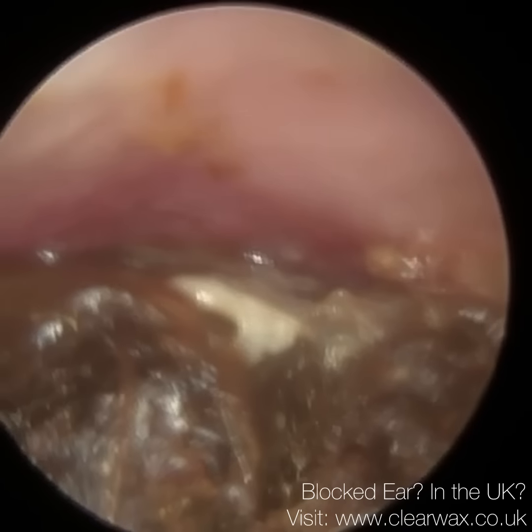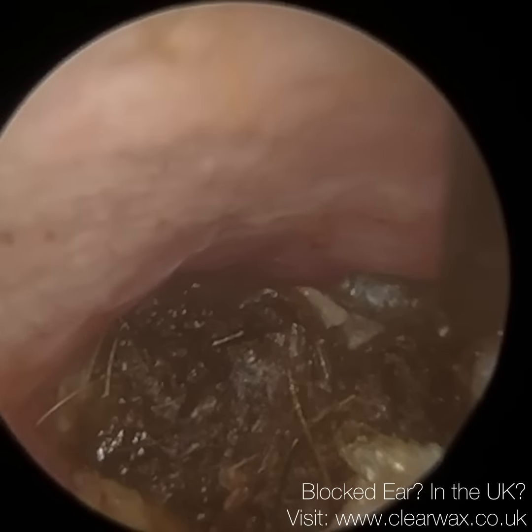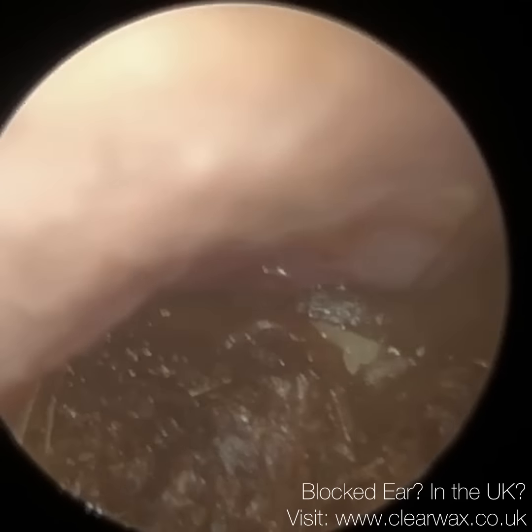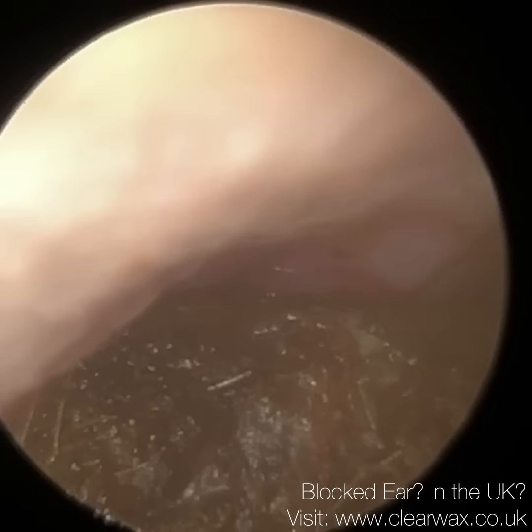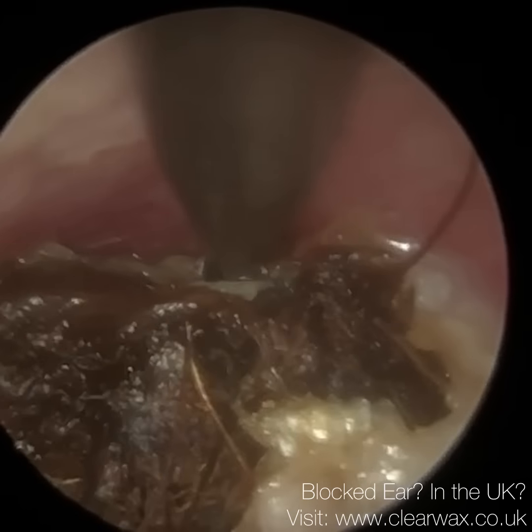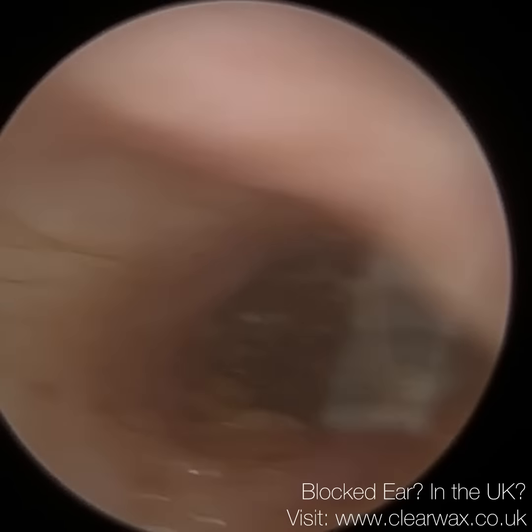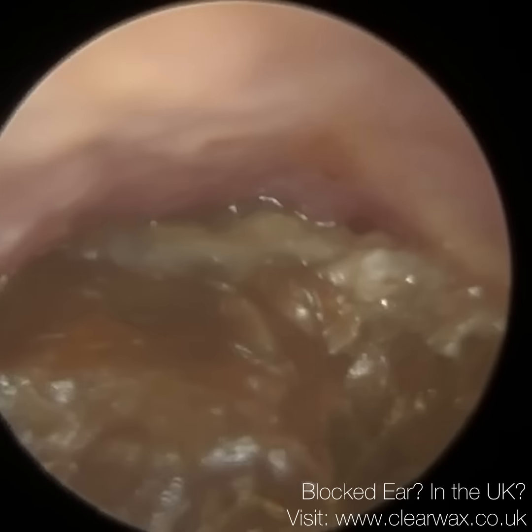And I think I'm going to also, so you can see there's an opening now. I think I'm going to glide now, possibly, the angled right ear hook. And because it's tapered, it's got a narrow tip, I'm able to glide in again into the narrow space. I'm now rotating it. I'm trying to bring this forwards, and it hasn't come away, but I have separated it from the back part of the ear canal.